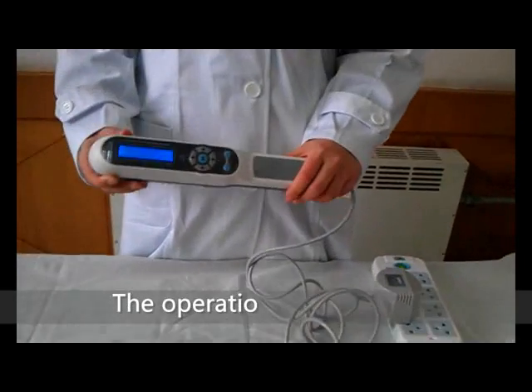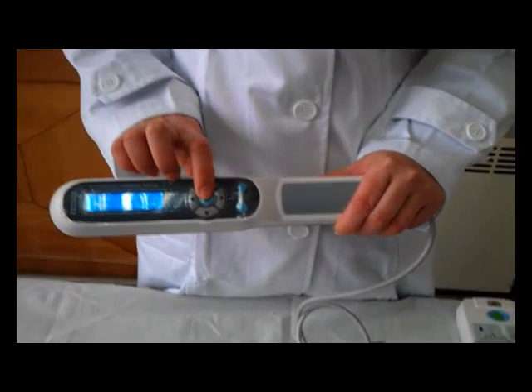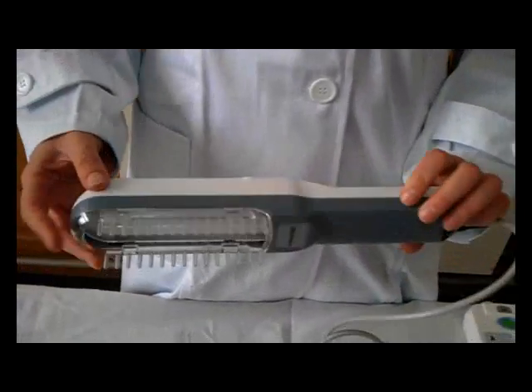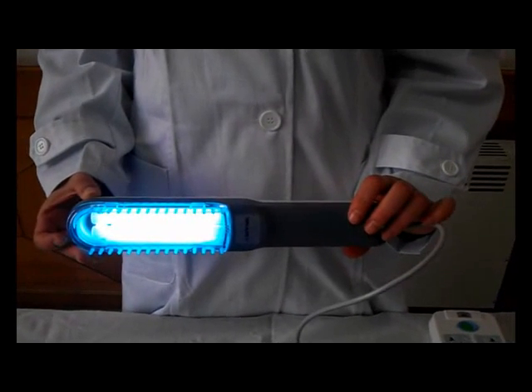Open the power switch. Set the irradiation time as per the use manual. When the lamp is on, it starts to do the treatment. For detailed operation, please refer to the use manual.